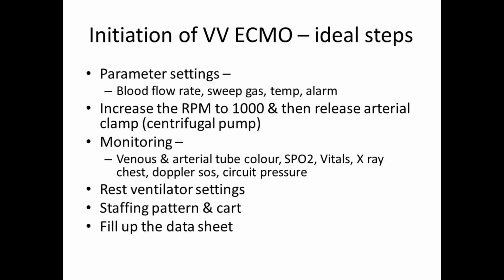Come down to rest ventilator settings. The moment you increase the flow, the saturations are fine. That does not mean you stop there. Start coming down on ventilator settings. Get to rest ventilator settings. Once you come to rest ventilator settings, your saturation is going to go down. So you go up again on the flow and get adequate flow and adequate saturations with the rest ventilator settings. That is what is most important.